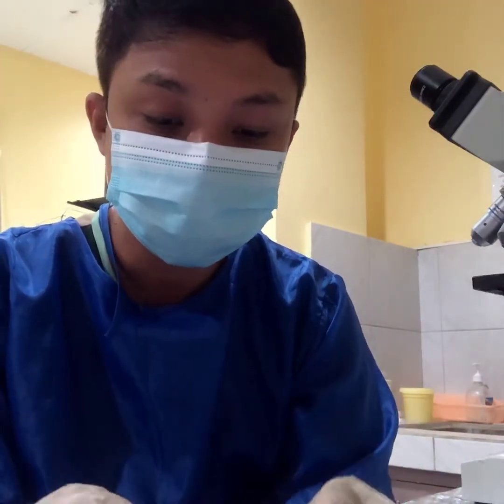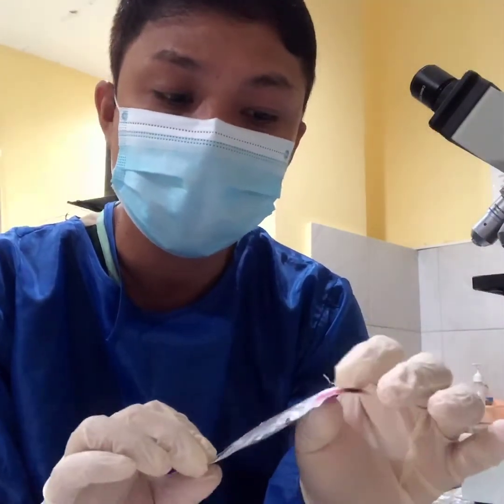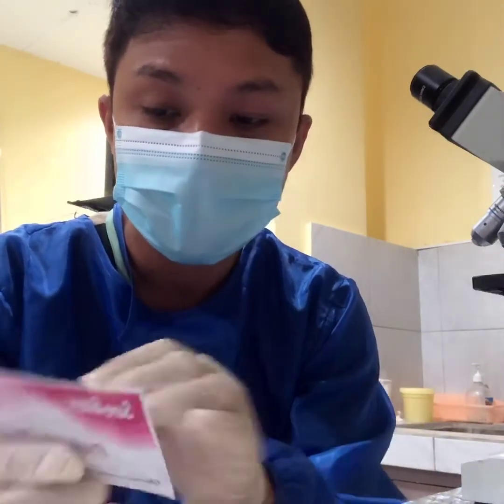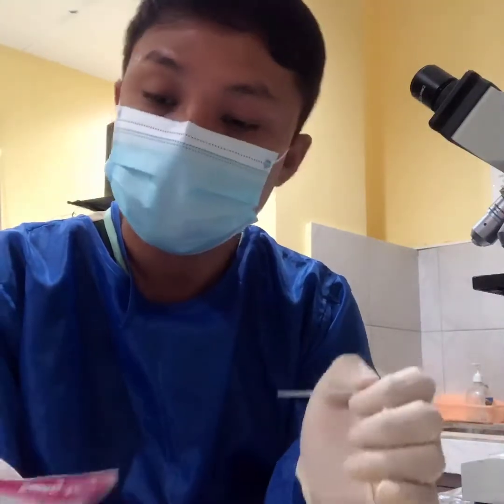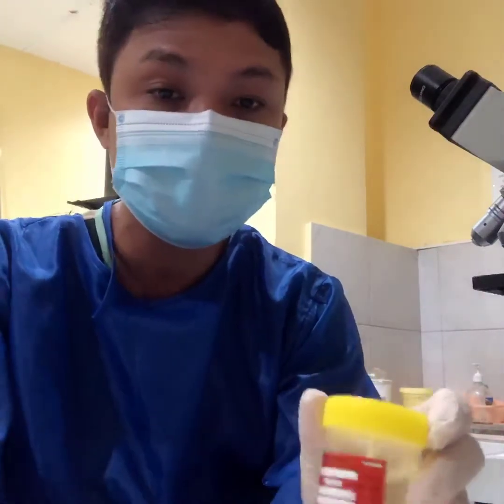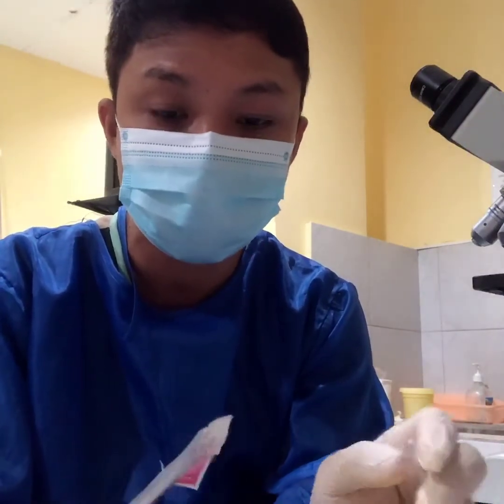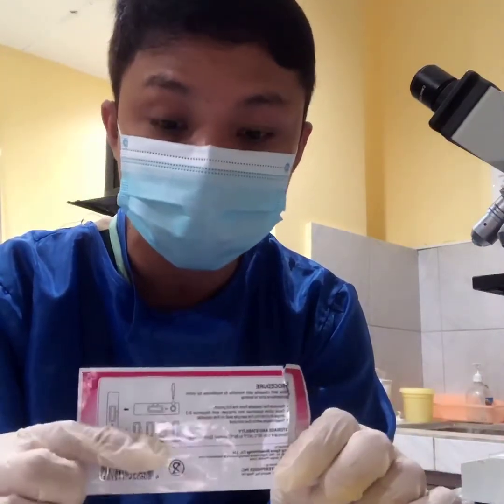The procedure is already included in the individual test kits. For our procedure, we only need 2 to 3 drops of the urine sample of our patient. Again, the pregnancy test is for determination of human chorionic gonadotropin, the hormone that increases during pregnancy.